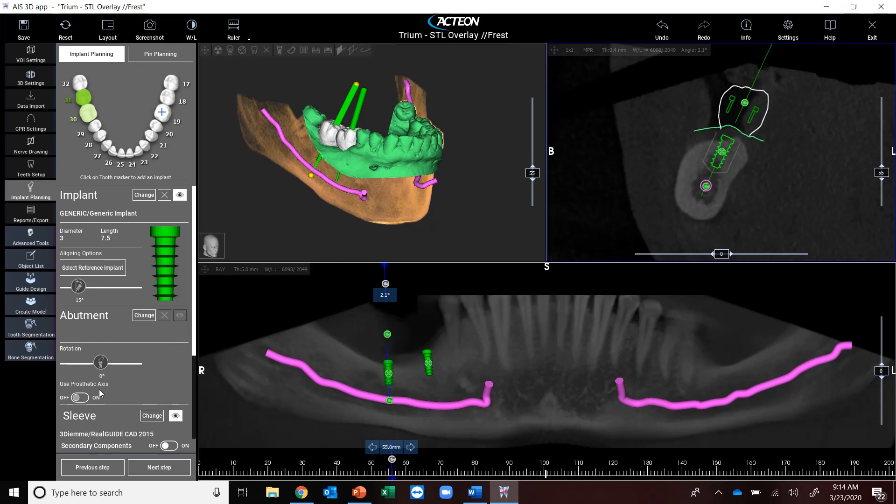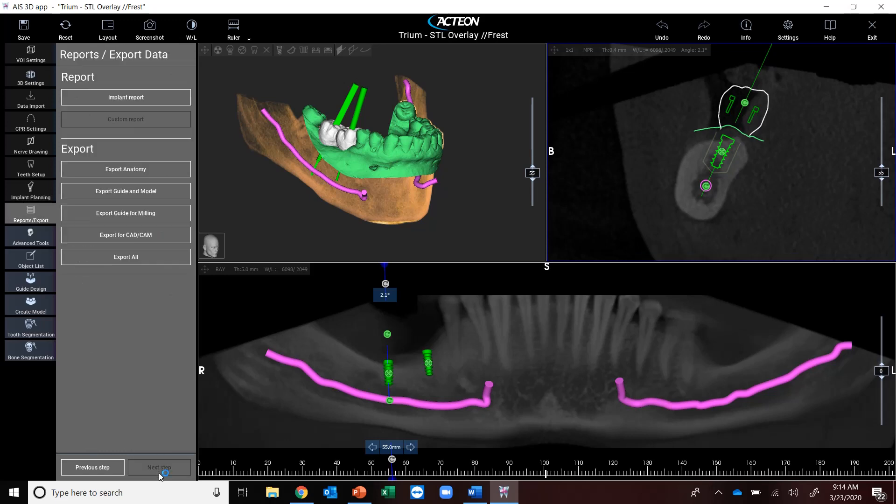So what I'll do is I'm going to go to next step once I've already done and inserted those implants into the correct position. And I'm going to pop down here to guide design.